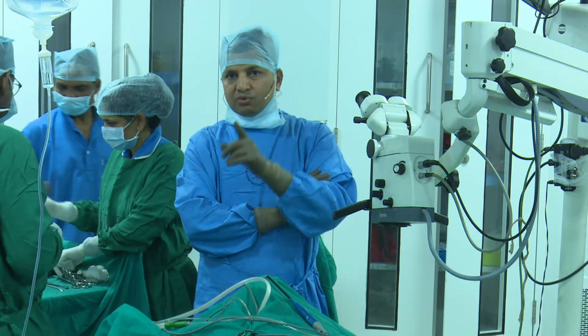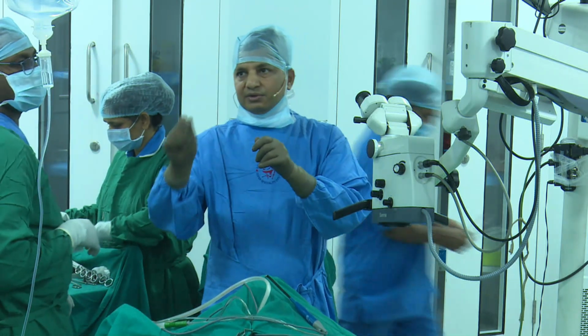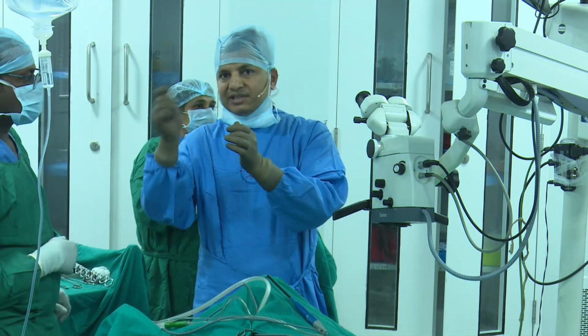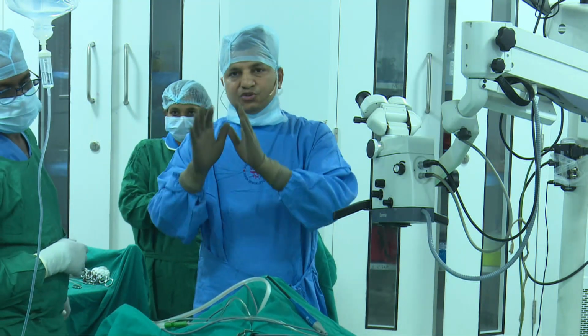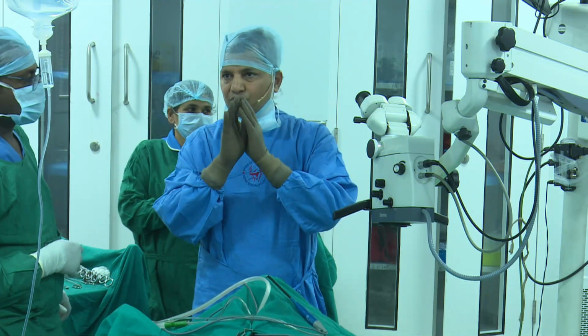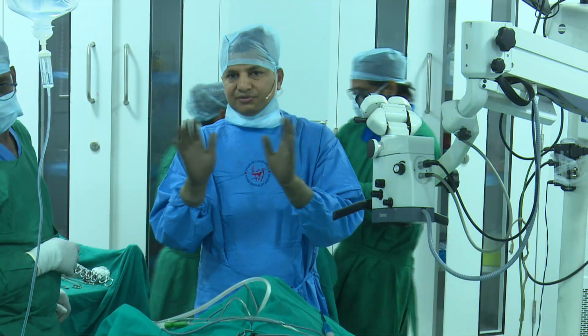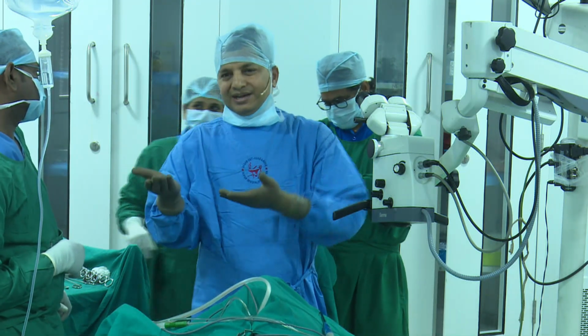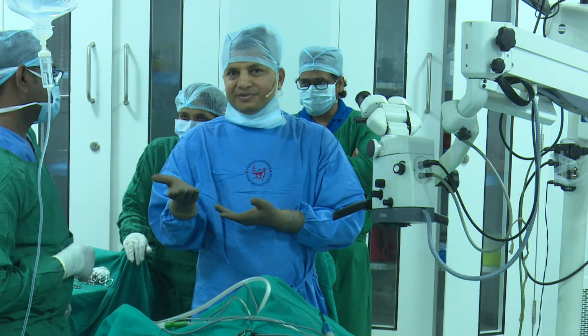A non-cutting round body needle lets you approximate the flap laterally with the pterygomandibular raphe without trauma, which you can do very well with Vicryl. You do not need a barbed suture if you do not have one. But for this AP collapse, this suture hardly costs 3,500-4,000 rupees, so it's not very expensive.